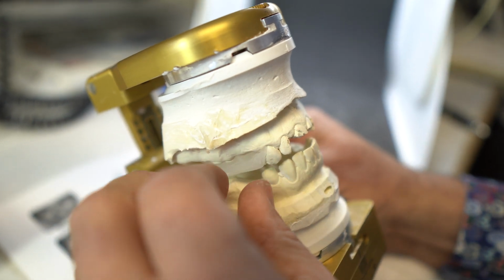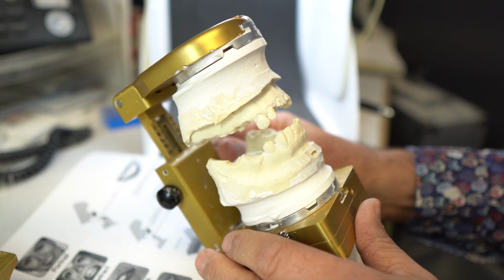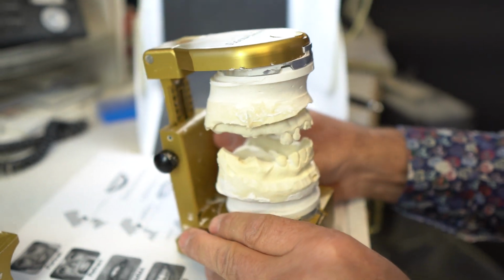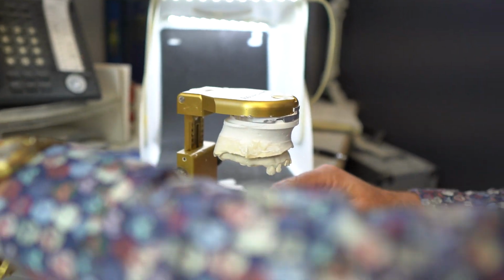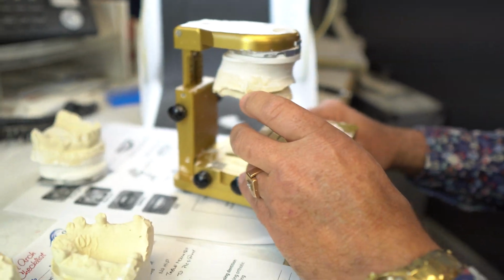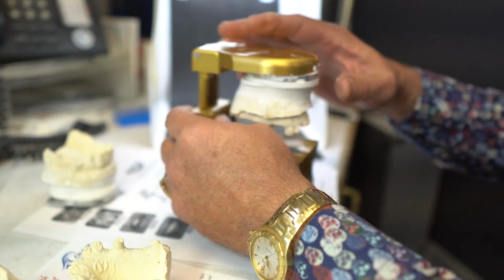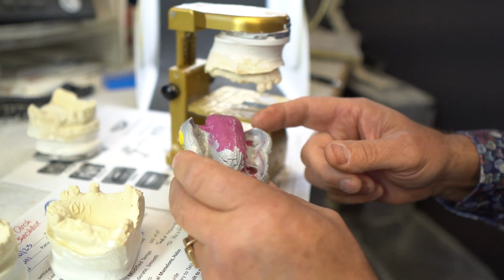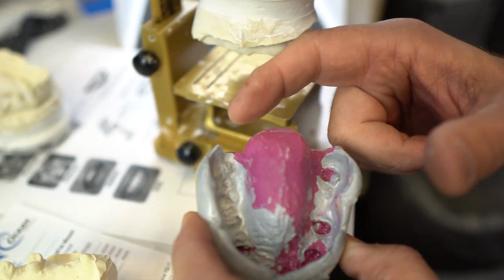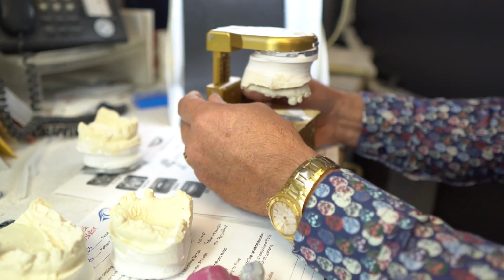I want to start first of all and talk about how we get a level plane of occlusion. Okay, how we build that. So we've got here a nice level table. This is the Aculine articulator. Now, unfortunately, in the impression, we did not get really accurate hamular notches back here. So we weren't able to actually hamular notch incisal papilla mount this case.